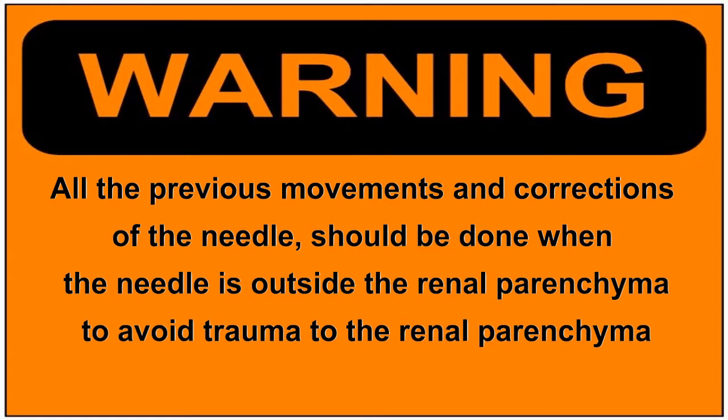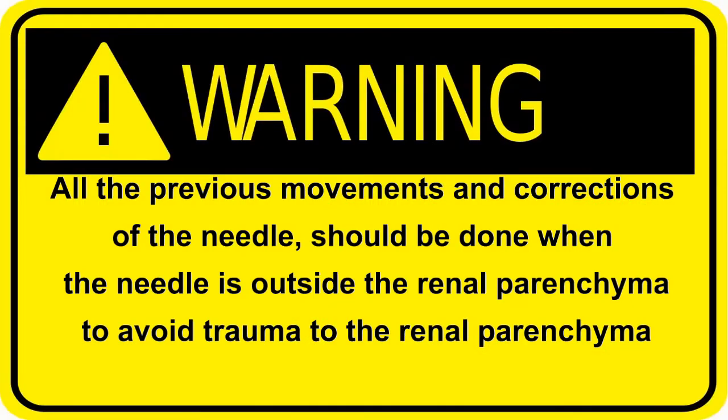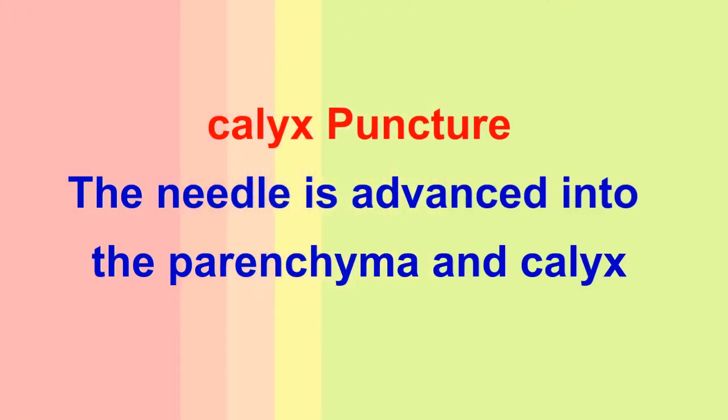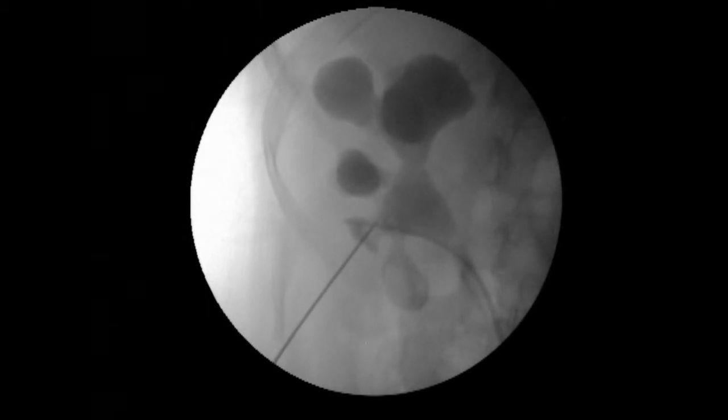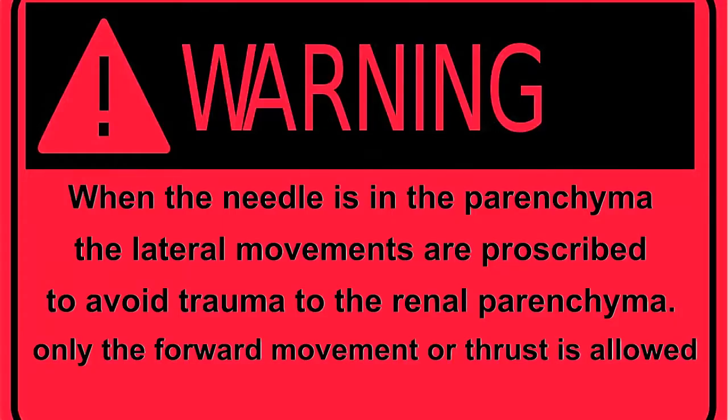All movements of the needle while searching for the kidney and moving the kidney have to be outside the parenchyma. When the calyx is pushed, it is a sign that the needle is in the correct tract. Then the needle is pushed forward into the parenchyma and into the calyx. When the needle enters the parenchyma, only the forward movement is allowed and all other movements are prohibited.